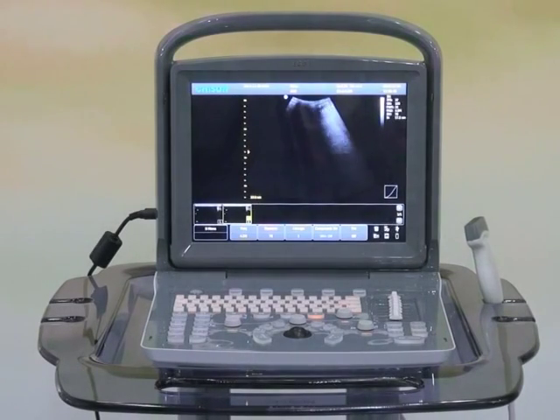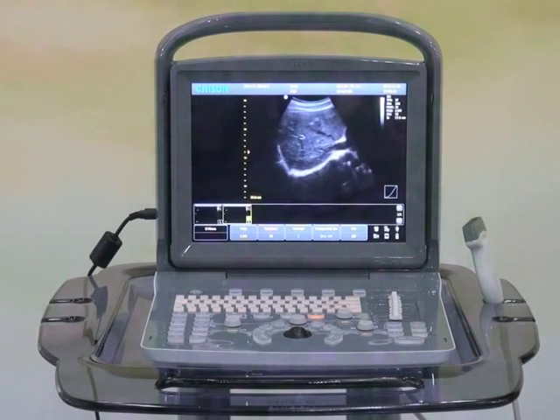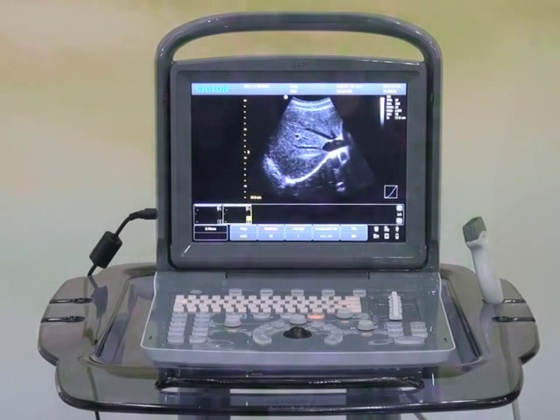The AquaOne has wide application from abdomen to OBGYN, from vessel to small parts, from human to veterinary.